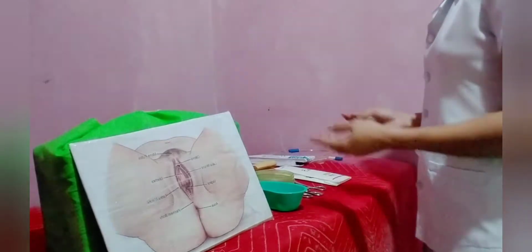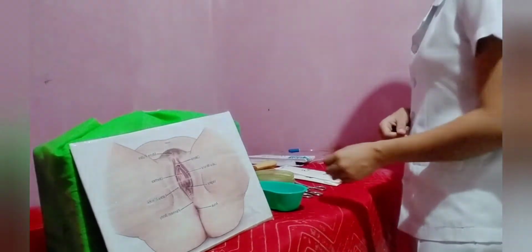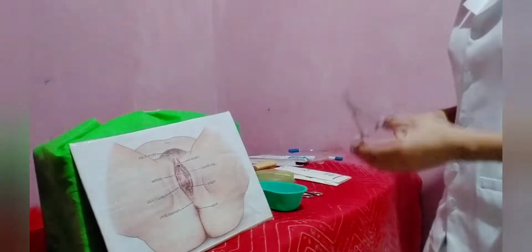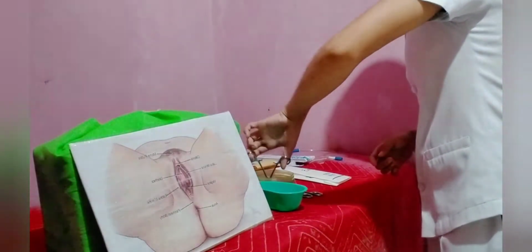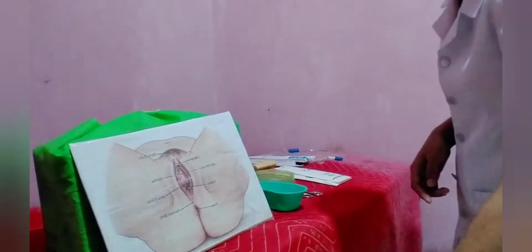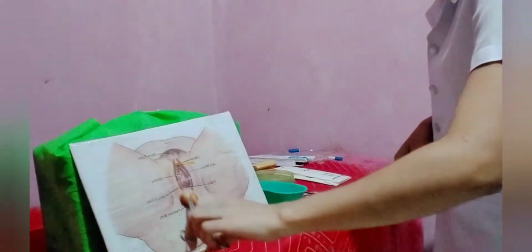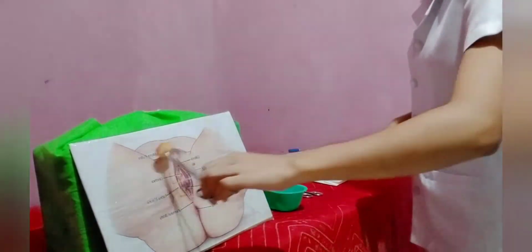So, I already opened and prepared the materials and equipment that we have to use. Next step is, using the sterile forceps, clean the area using cotton balls with betadine, like this. Then down to the anus, then discard. And repeat on the other side.